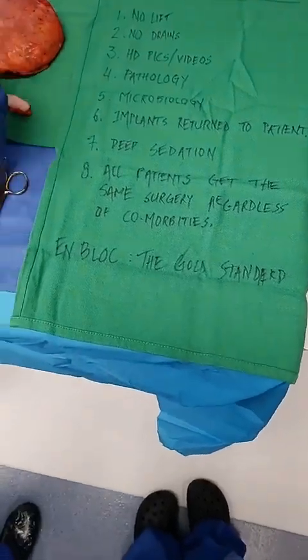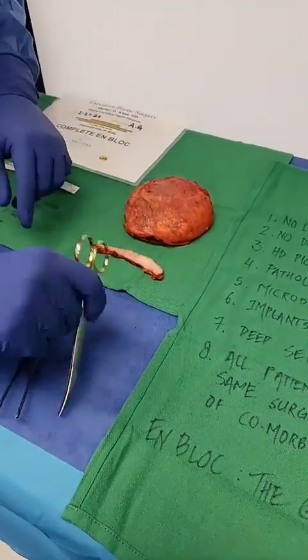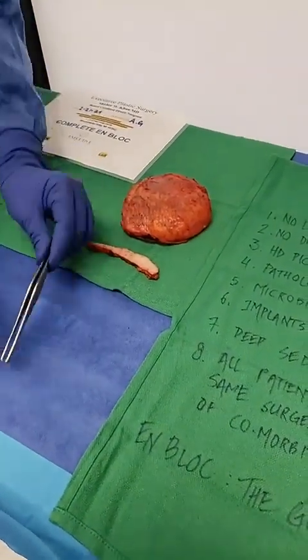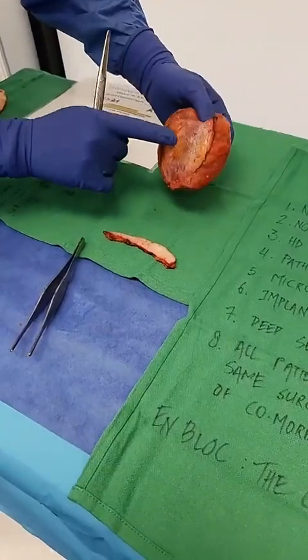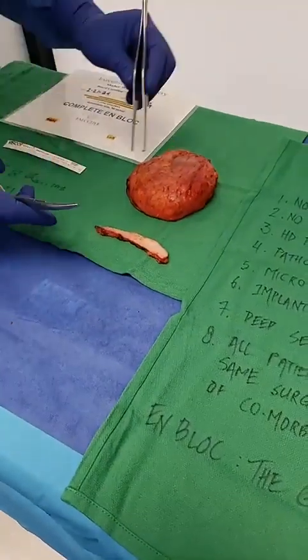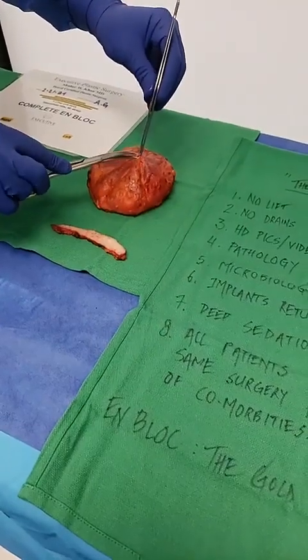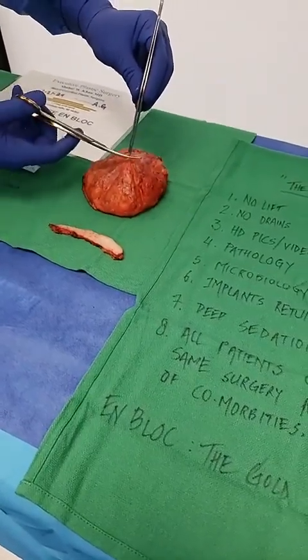Now let's go ahead and open up the left side. I cut out the excess skin, that helps. Now let's go ahead and look at the back. Again, relatively some areas thin, thick, and these are implants that are 33 years old, and good for her that they are very much intact.